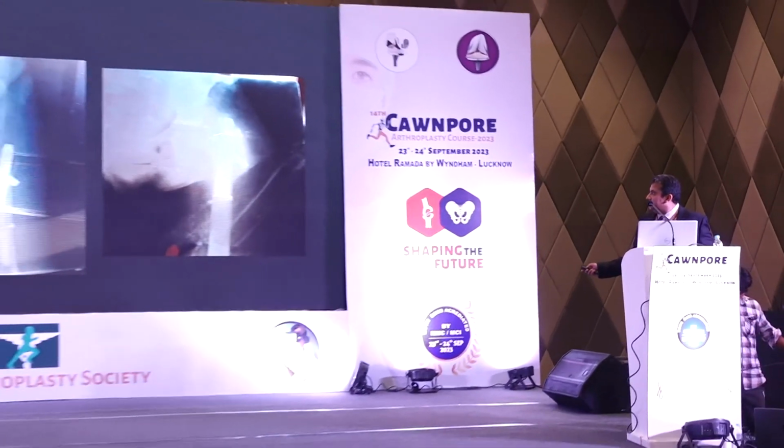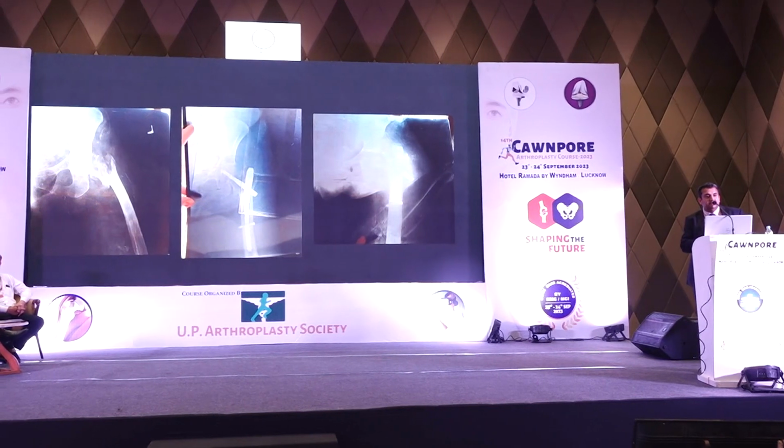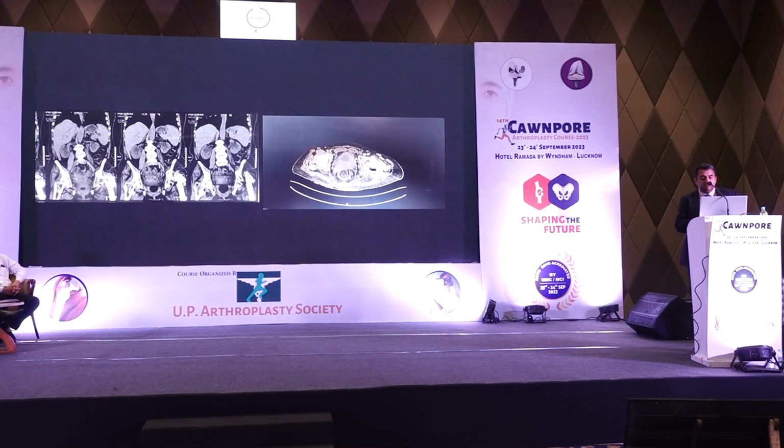This is how she presents to me with a lot of shortening. And you can see the screw of the PFN has already been removed. These were the initial X-rays, of little poor quality. This was the IT fracture which was actually fixed with the PFN. I think they did a pretty good job as such, but for some reason it failed and the screw cut out. The surgeon just removed the screw. I don't know why he did not go in and intervene again, but she came to me in a neglected way after almost 2 years.